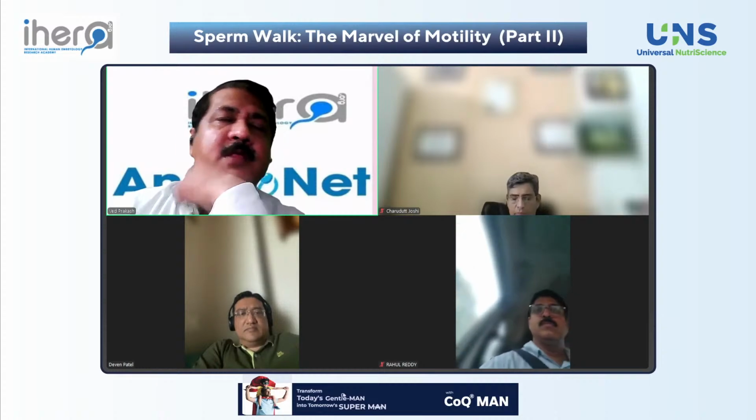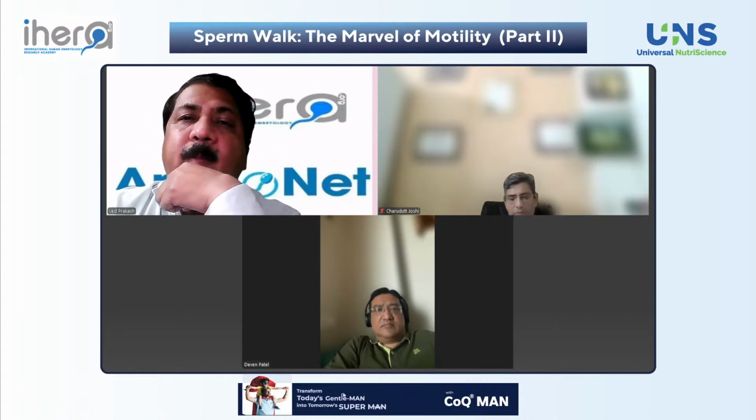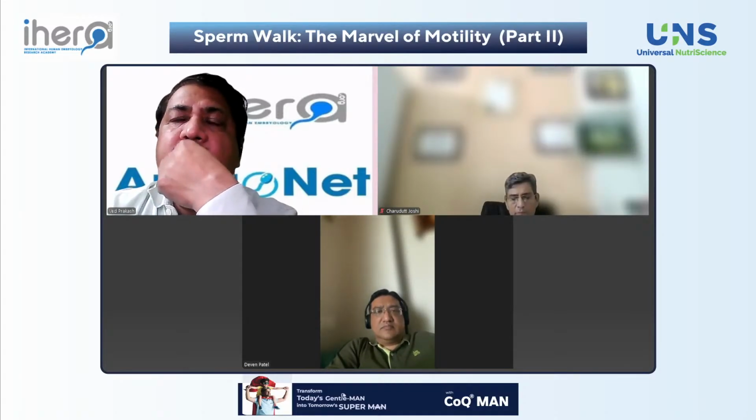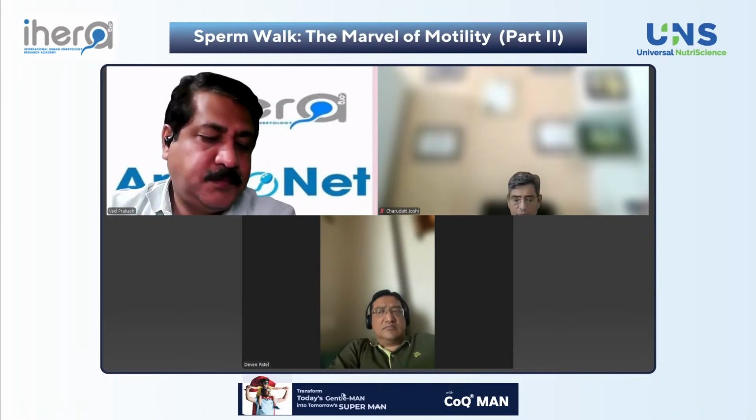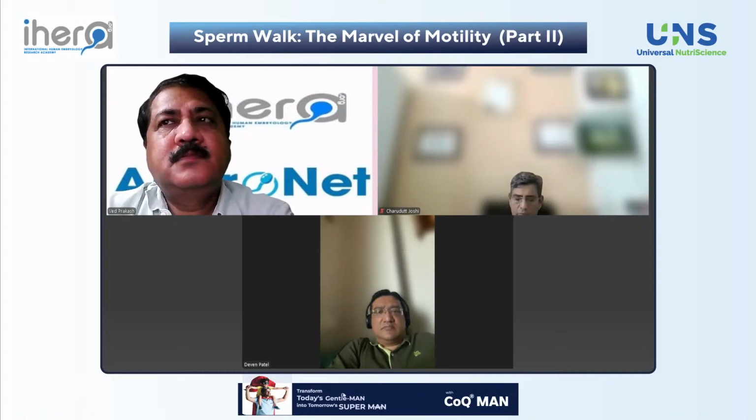And I think achieving the scales which are present in nature would be a real challenge, because a few tens to hundreds of sperm are surrounding the OCC complex in nature, in vivo in the oviduct. If we are able to reach that level, then we are definitely improving our selection in terms of the sperm numbers required to fertilize the oocyte successfully.